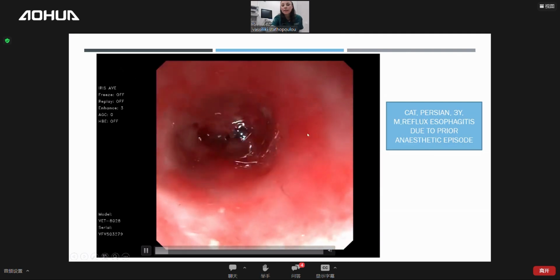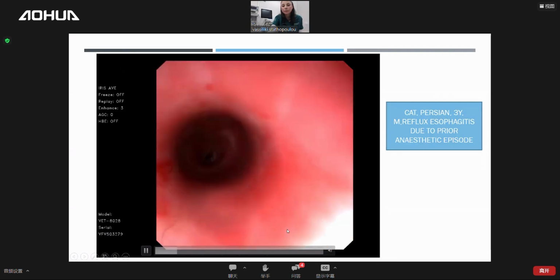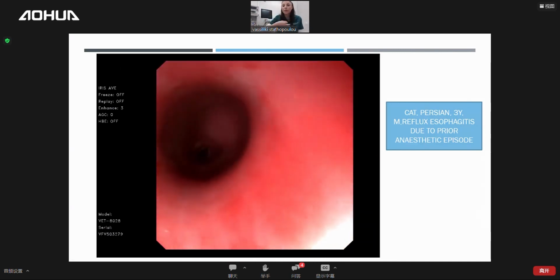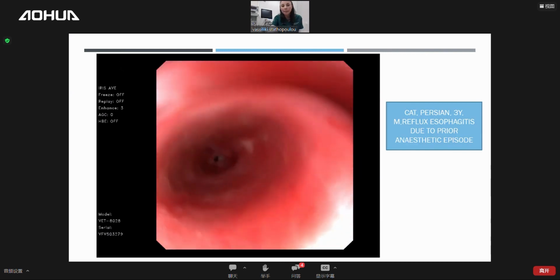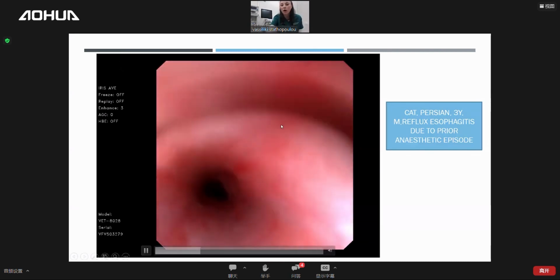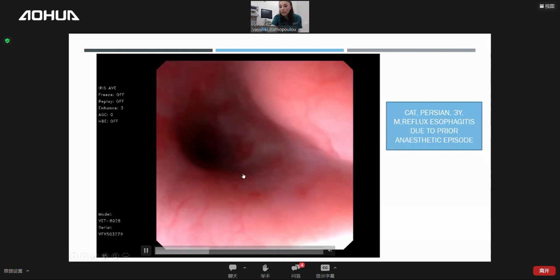So you see the kind of esophagitis, circumferential, stage 3, because all the gastric fluid has come into the esophagus. And we got into the stomach, it actually has started to form a ring. This is why I'm going back and forth with the tip of the scope in order to open it, and then we will give medication in order to prevent it. Okay. And you see that the further up we go, the better the esophagus looks. Of course, this cat has vomited throughout the base of the heart. So there are lesions because the reflux disease has been up to the base of the heart. There are lesions up to this point.